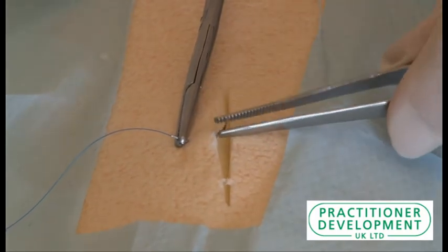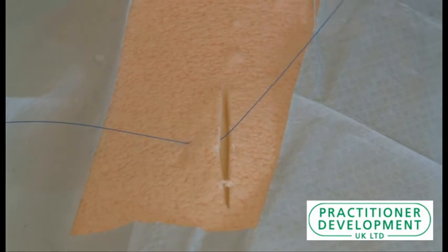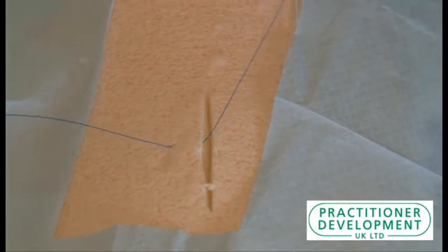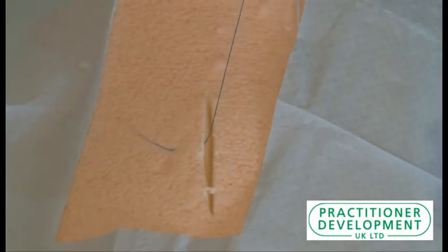We're then going to use the non-toothed forceps to help us pull this through on this side, and again we're going to re-hold the actual thread itself.